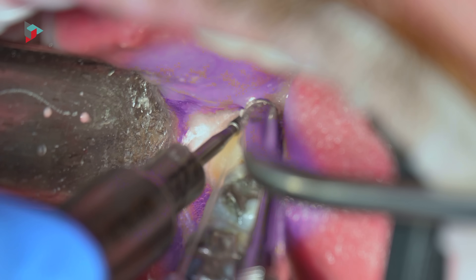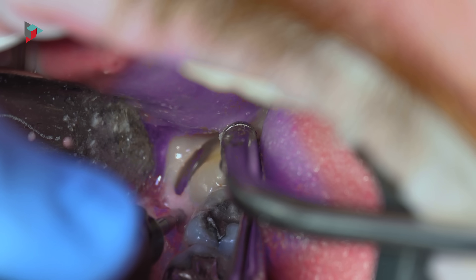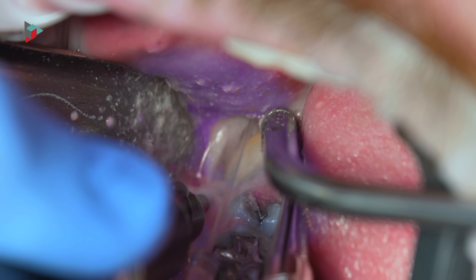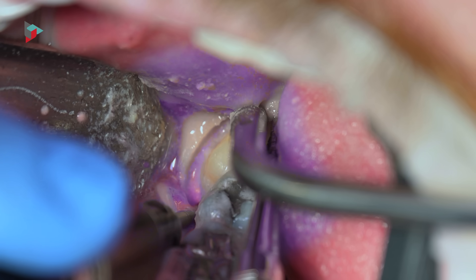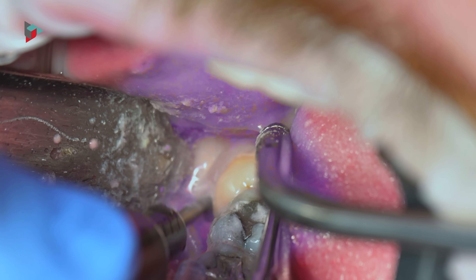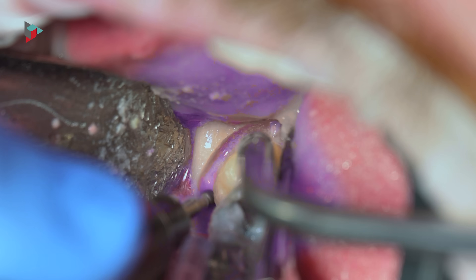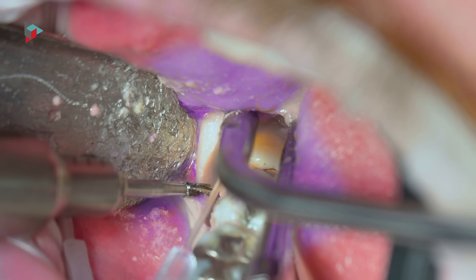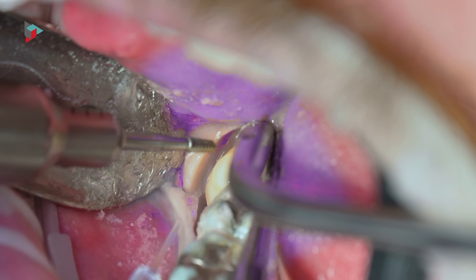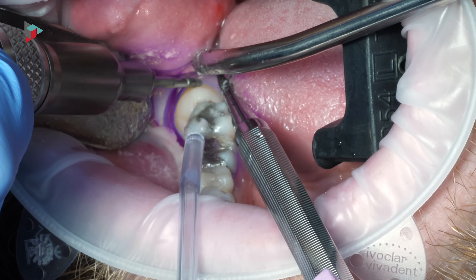The surgeon makes an incision in the gum tissue to expose the impacted wisdom tooth. Then, using dental instruments, the surgeon will carefully section the tooth into smaller pieces. Each piece will be removed separately, starting with the largest and most visible sections.